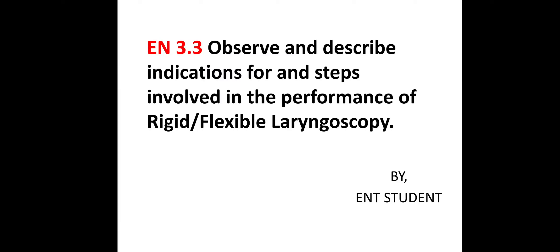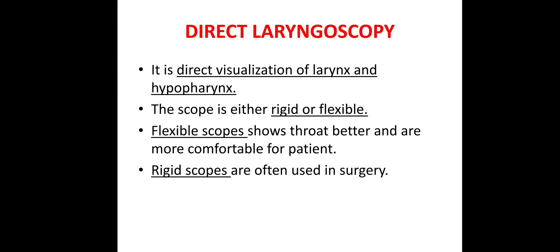Good morning everyone, this is an ENT student. Today I am going to talk about ENT competency number 3.3: observe and describe the indications for and steps involved in the performance of rigid or flexible laryngoscopy.